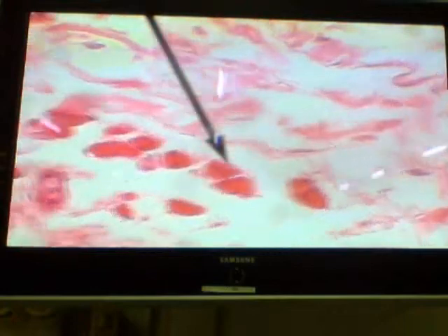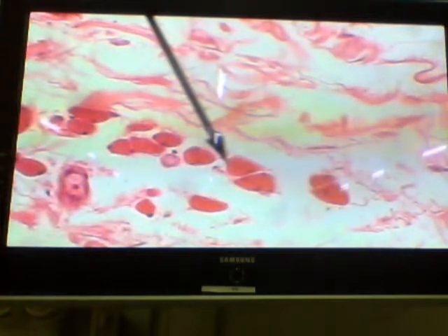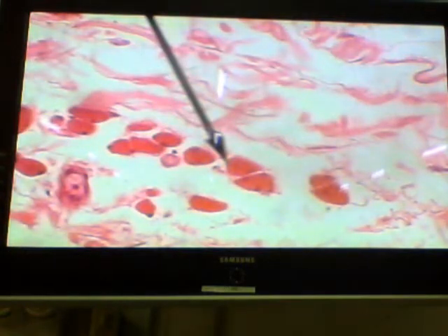So you're going to find regular connective tissue elements, blood vessels. What are these sharp red areas that we are seeing here? What are these? Under the pointer. Skeletal muscle. What skeletal muscle is present within the lid? Skeletal muscle in the lid is what? Some of it is going to be from what?